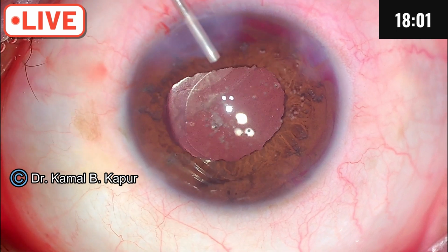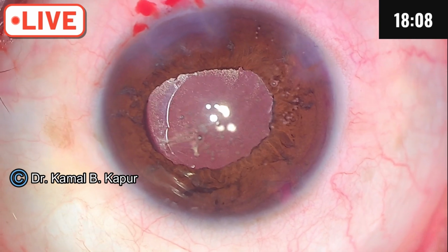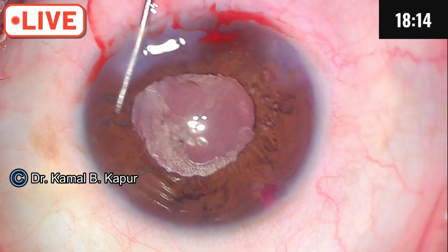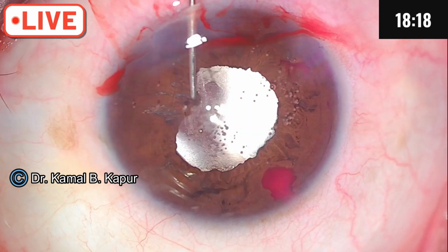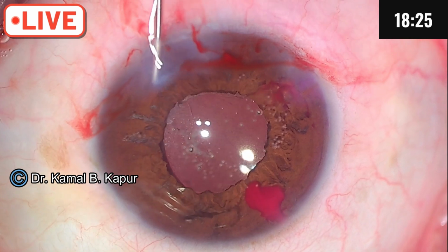I will push some visco in that area to stop the oozing. Meanwhile, I'll try and manipulate my iris because it has been stuck there for a long time, so it's a little atonic iris there in that area. If you plan to do this maneuver, do this very gradually. We don't want another iris bleed.